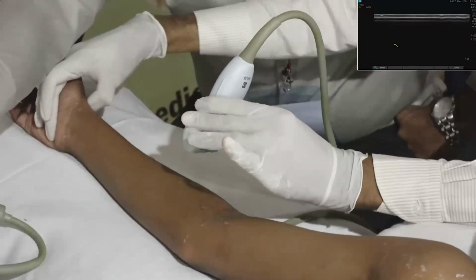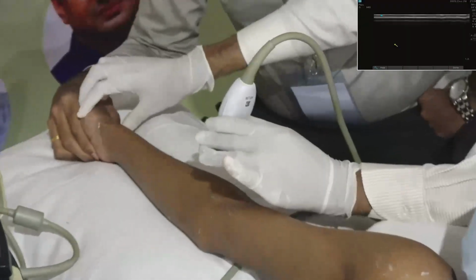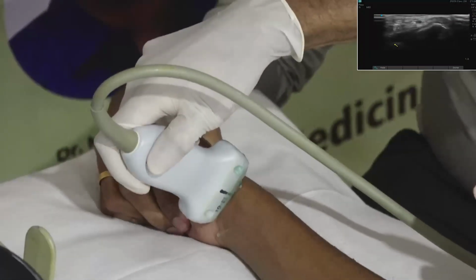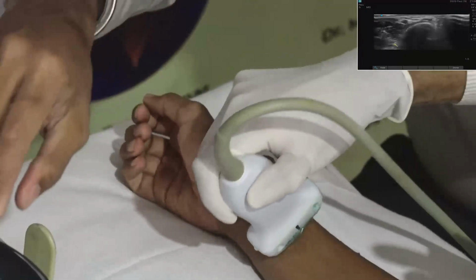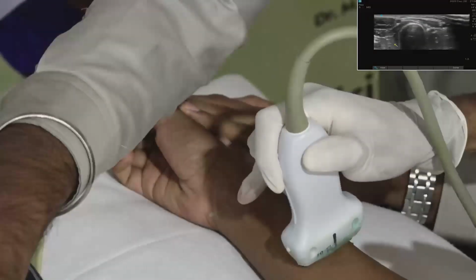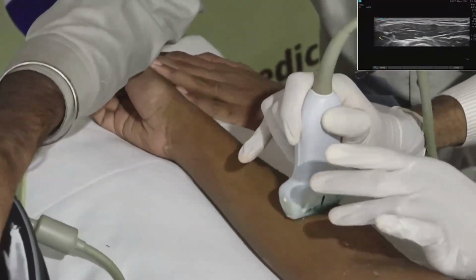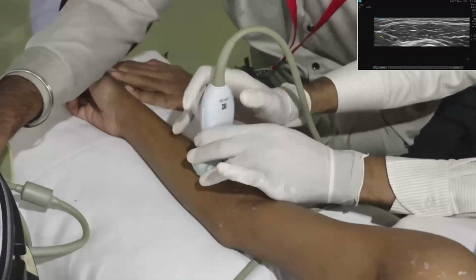Preferably, if you want to scan, I have some difficulty in scanning the brachioradialis muscle. You have to keep the forearm in the mid prone position. Now you have to look for the brachioradialis. Now you can see some hyperechoic component.